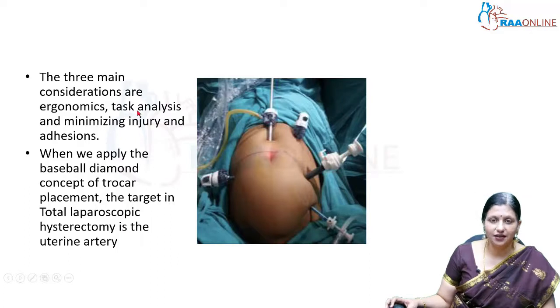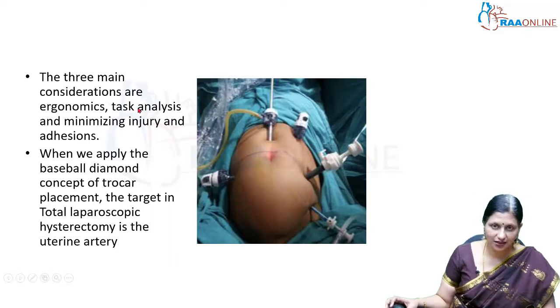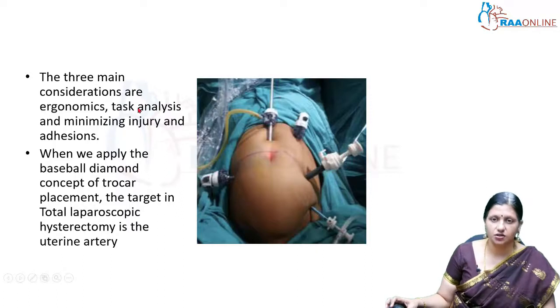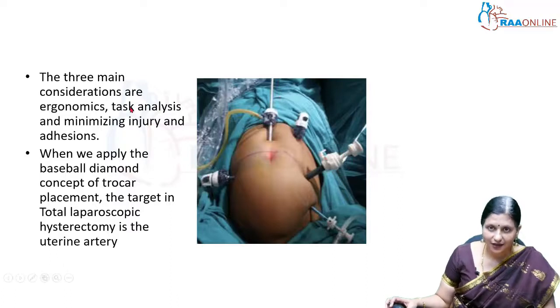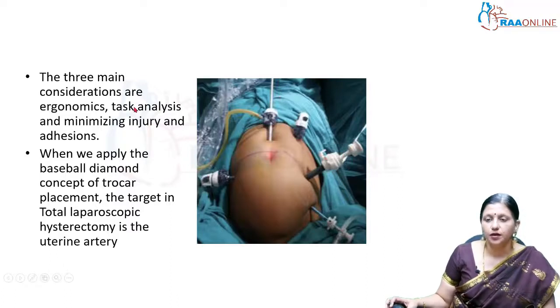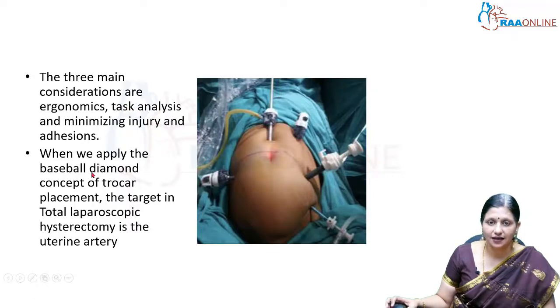When we analyze the task, we have to identify the target. In a total laparoscopic hysterectomy, the target is the uterine artery, which is the most vascular structure. In a salpingectomy or salpingo-oophorectomy, the target is the ovarian artery in the infundibulopelvic ligament. We place ports depending on the position of the target.